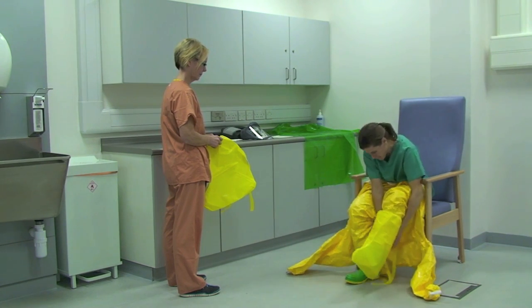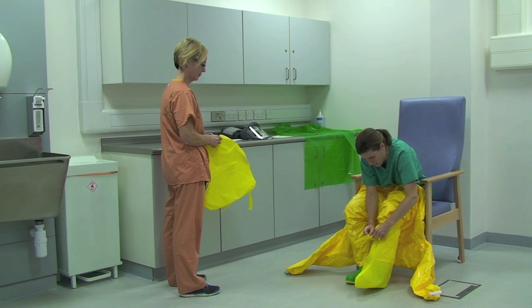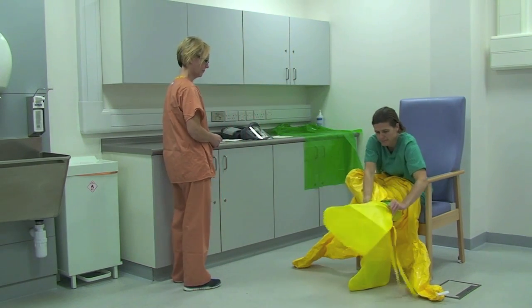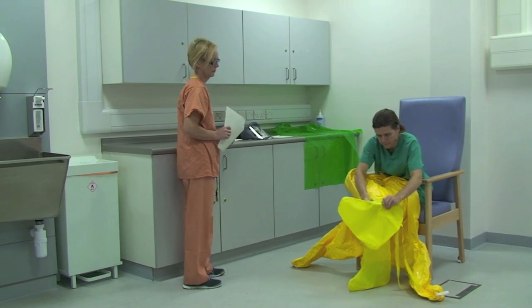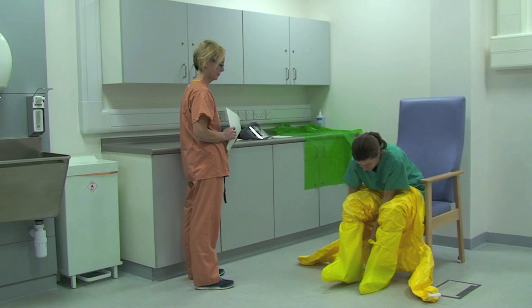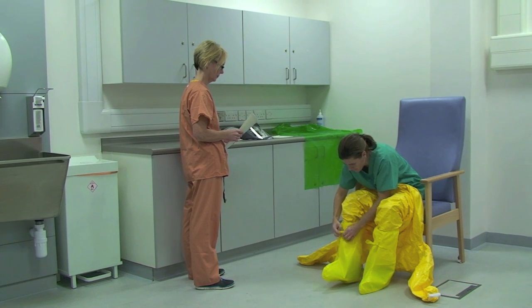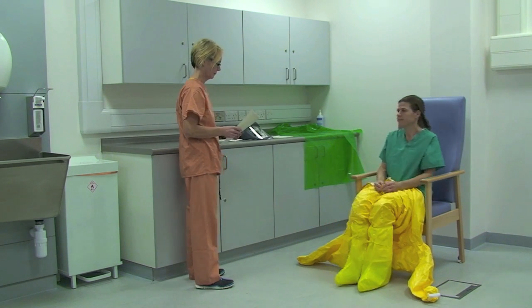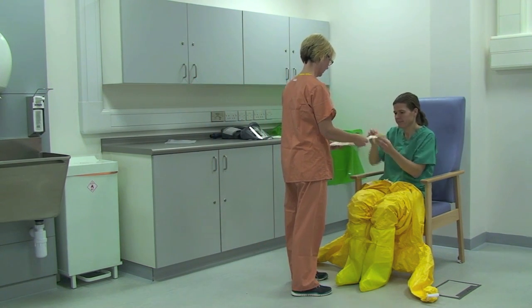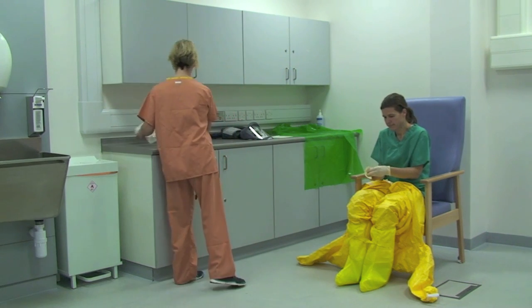The healthcare worker puts water repellent overboots on top of the boots and coverall and ties at the front. The healthcare worker then puts on the first pair of sterile gloves and pulls the coveralls up to their waist. Remember, sterile gloves are only worn to ensure a tight fit and not for sterility purposes.